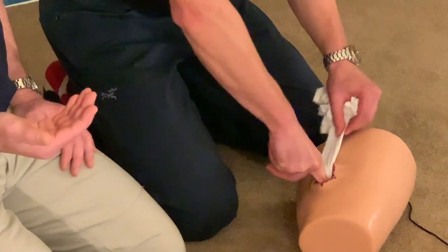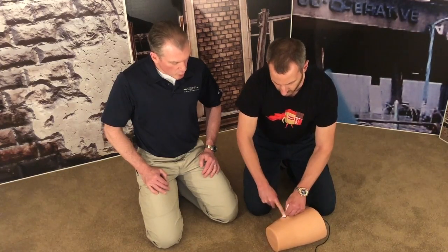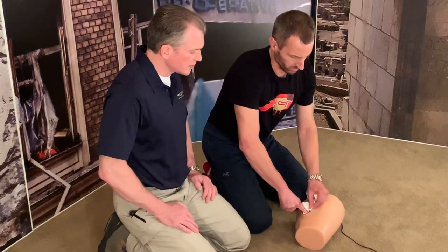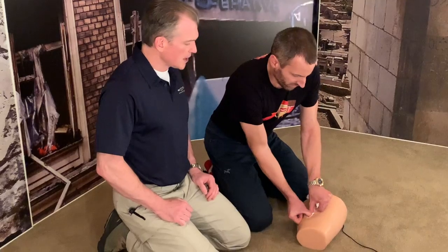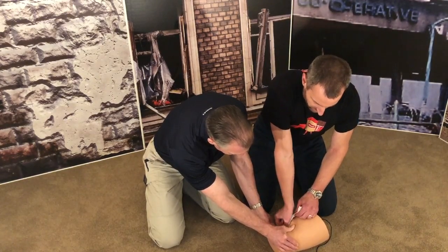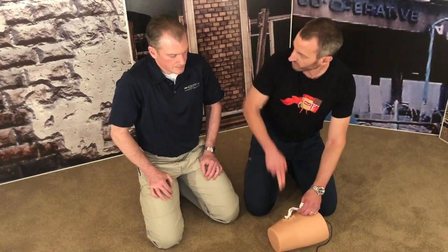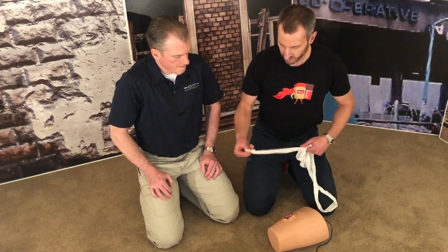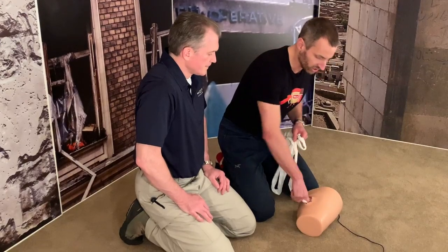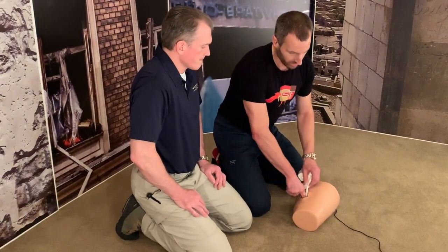The goal in wound packing is no matter how much gauze you get in the wound, if you really push harder, you'll get more gauze in there — just keep packing. At some point when the wound cavity is pretty full, you can usually get more gauze in there if you start to spread the edges of the wound apart a little, deform the wound a little. I realize as I'm doing this that I've released pressure for at least a second or two as I've gone back — because it's been: take this, and I have not made a missile with my finger in here. It's just been: loose end, shove in, come out — not feeding to myself. One hand packs, this hand loads — like a sewing machine.